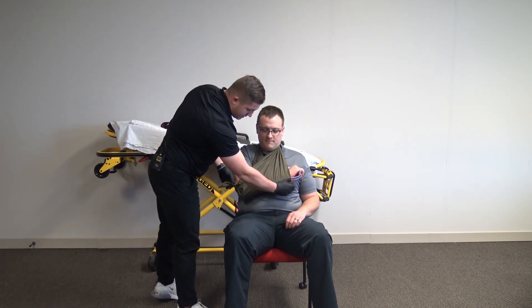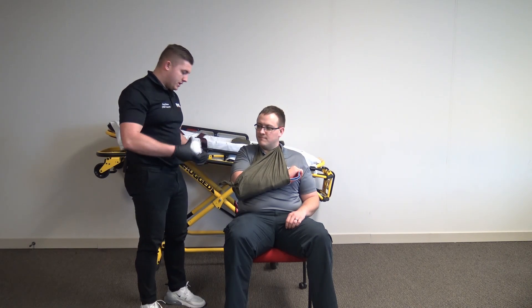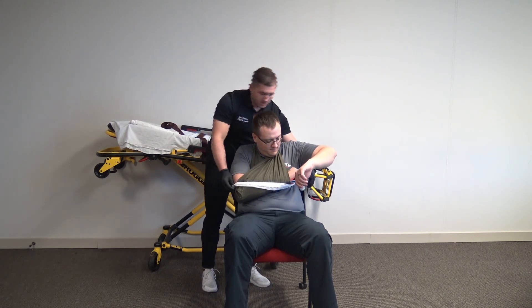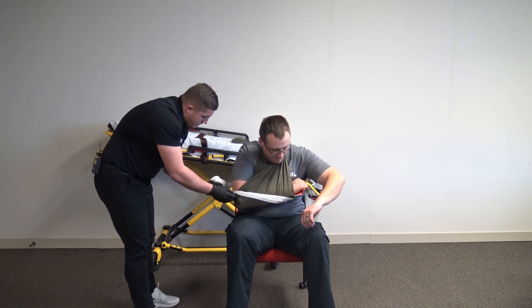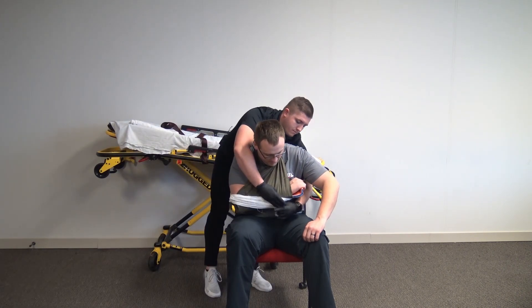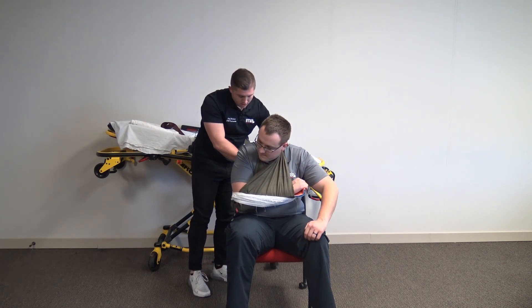I've got my sling. I'm going to make sure it fits properly. Now I'm going to do a swathe — I'm going to use another Curlex and make sure I'm securing the entire extremity to his body. I'm going to come just underneath this arm. I'm going to ask my patient to lean forward — thank you. I'm going to continue to wrap this around the body, making sure I'm tucking this elbow and making sure it's nice and secure. I'm going to tie it off in the back, and you can lean back for me.